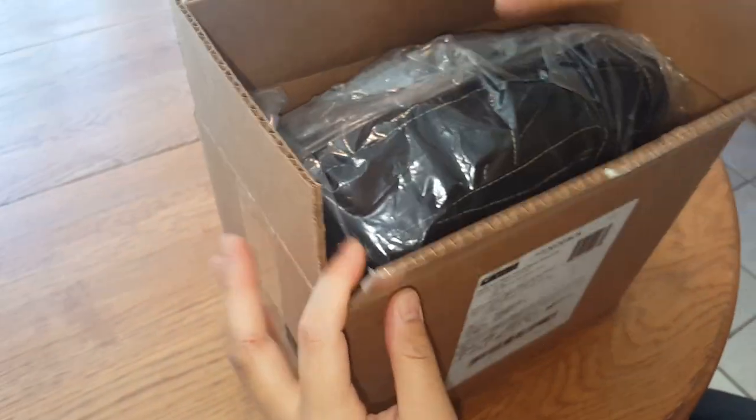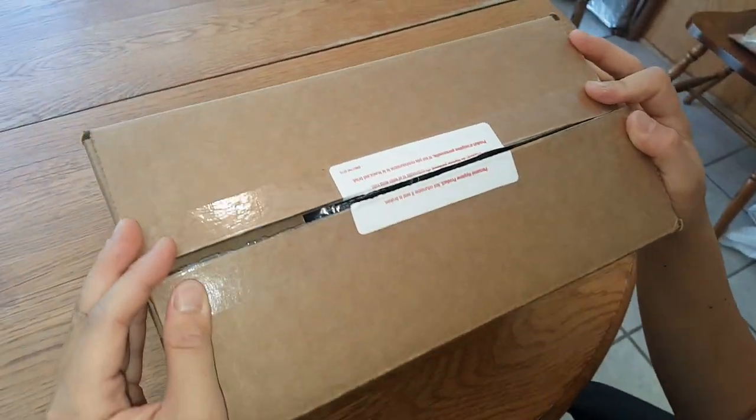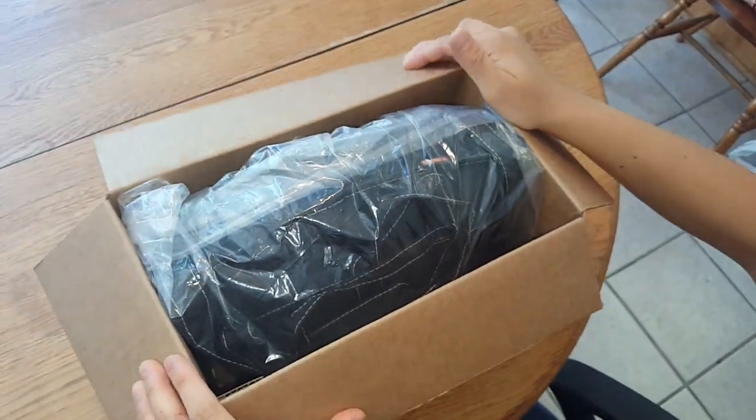So I've already opened it, but when I bought it, it was sealed. Didn't look like it had been tampered with. I paid about $50 off of Craigslist, which I think is a great deal.